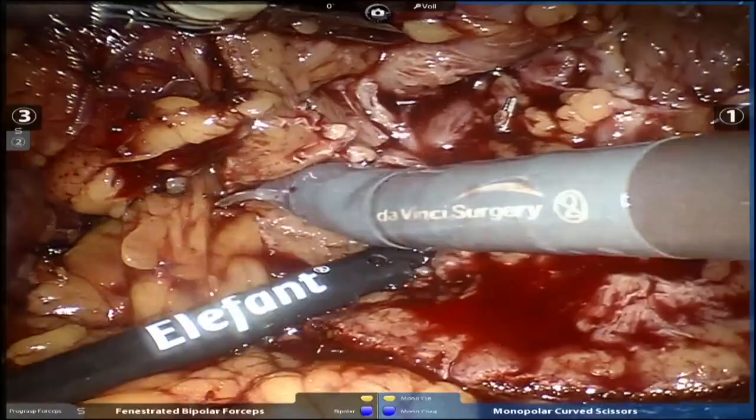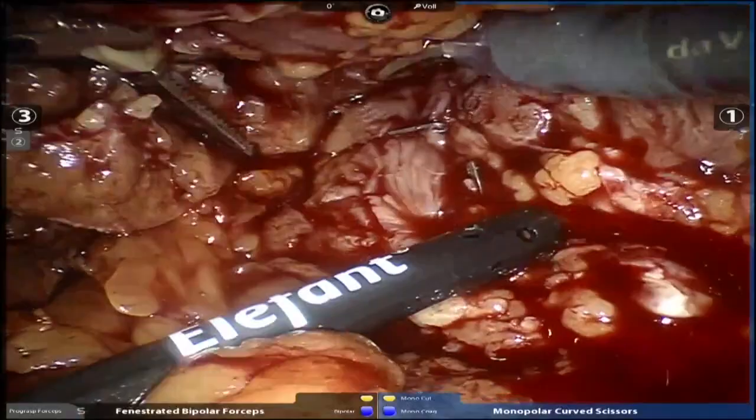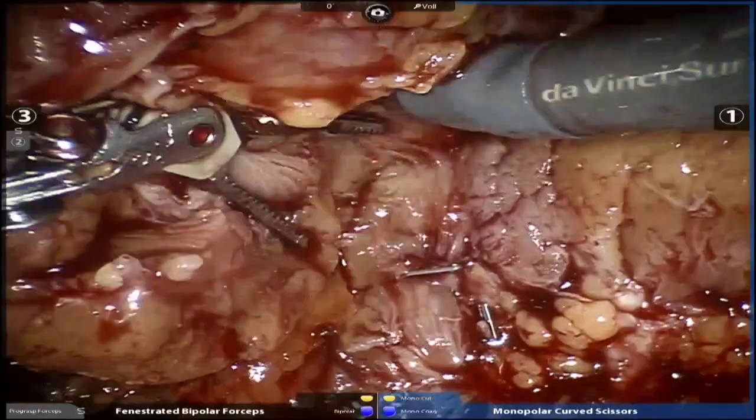You okay? Okay. I don't know if we'll bag this, Brandon. It might just be too big. We're just going to throw it in the lower retroperitoneum.